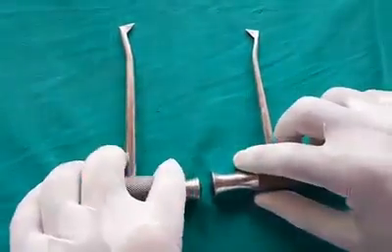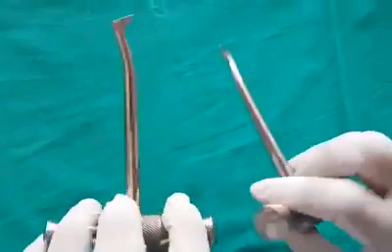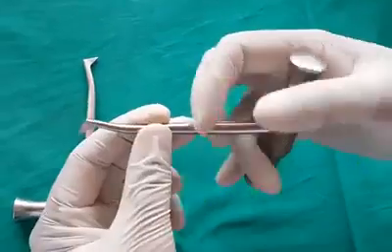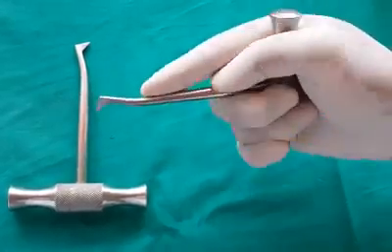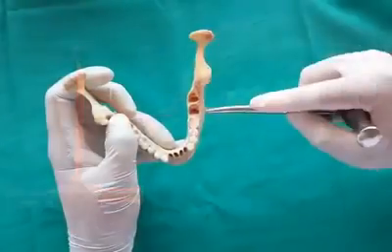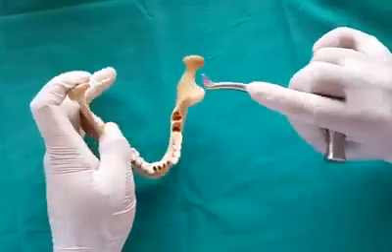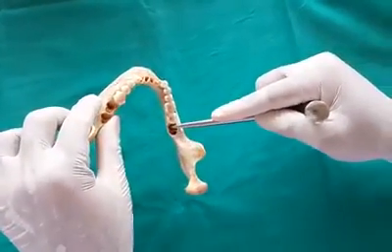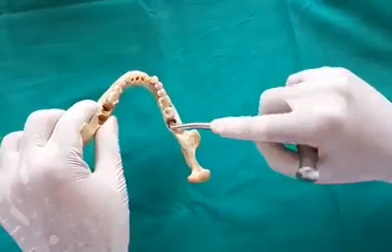Crossbar elevator, also known as Winter's crossbar, is a paired instrument. If one is used as distal on the right side, it can be used as mesial on the left side and vice versa. It is held in palm and thumb grasp and primarily used on the wheel and axle principle. It is used for extraction of mandibular teeth, and is useful when one of the roots has been removed — the elevator is used through the socket of that root to remove the other roots.